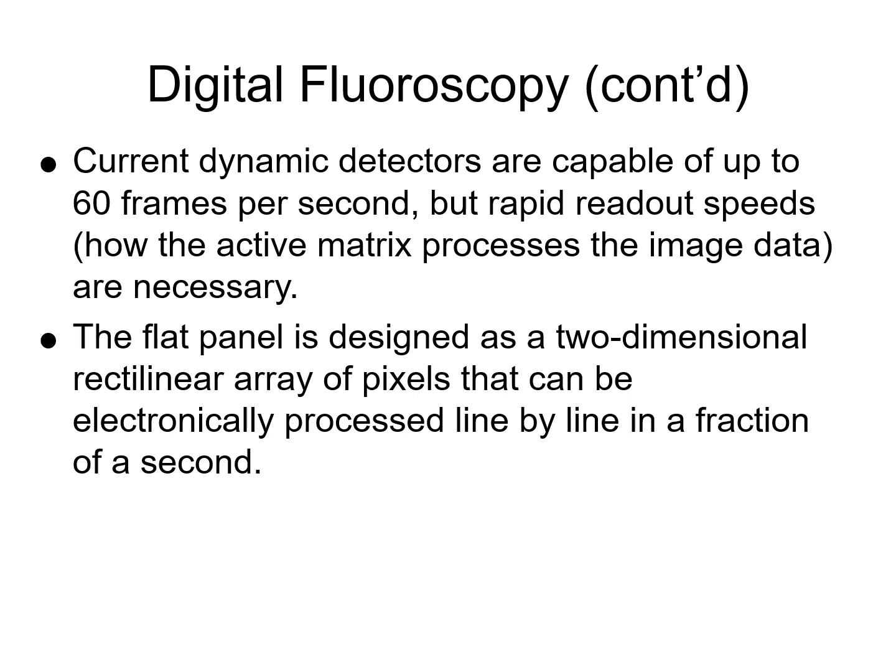The human eyeball, as far as visual acuity goes and being able to take in information, has limitations. One of the limitations is it can't tell the difference between rapid still frames and fluid motion. I alluded to this with video game players: 15 frames per second looks like strobe light. It looks choppy, the motion is stilted or in chunks, if you will. But once you kick it up to 30 frames per second, somewhere between 97 and 99% of the population is fooled into thinking that's fluid motion.